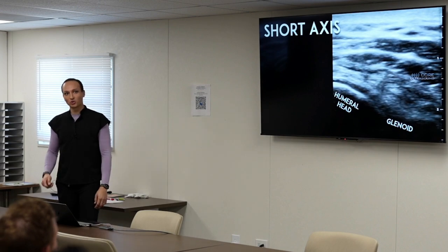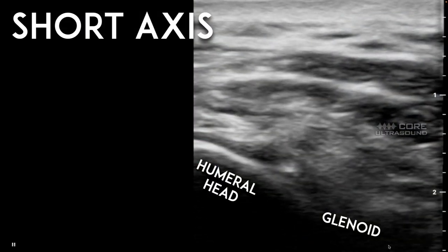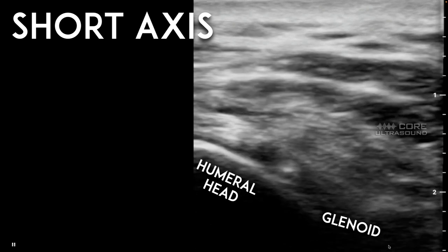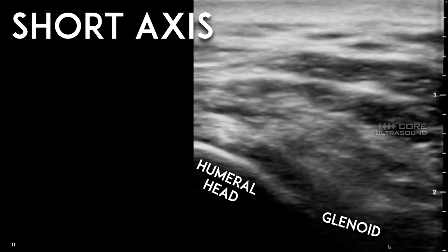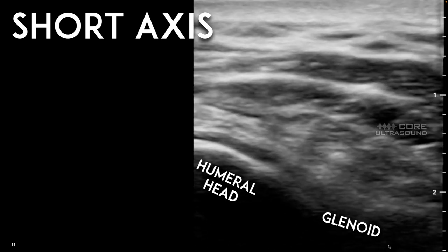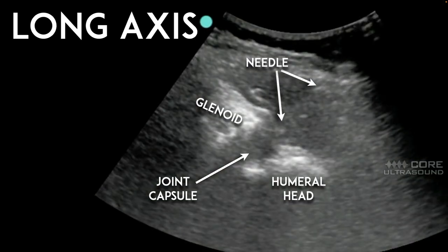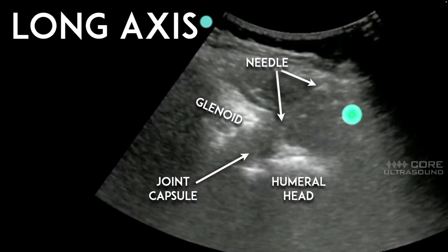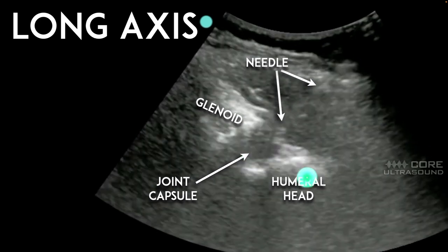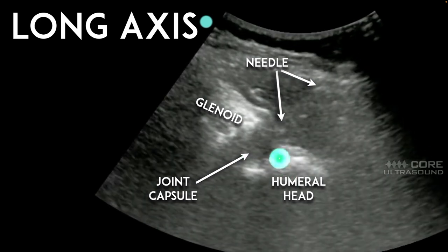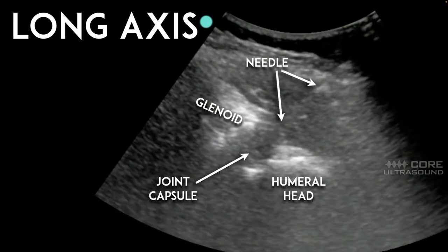In the short axis approach you can see the humeral head and the glenoid — and right there is the needle tip as I push anesthetic in, causing the joint space to expand slightly. In the long axis approach you can also see the needle entering the joint. This shows a dislocated humerus with a spinal needle injecting directly into the joint to facilitate relocation.